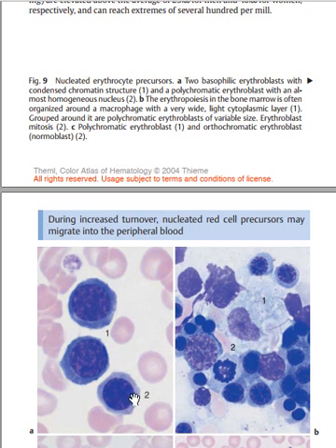Is it clear? The polychromic erythroblasts are shown here, and they have different colors at the level of the cytoplasm. The explanation for this change in colors is that at first, in pro-erythroblasts, you only have a very large nucleus which exists as euchromatin. Later on, the nucleus produces ribosomes. The more ribosomes are produced, and the more hemoglobin is produced, the cytoplasm is going to change to pinkish. At first it's called pro-erythroblast. Then you have the erythroblast which is only bluish because there is no hemoglobin produced.